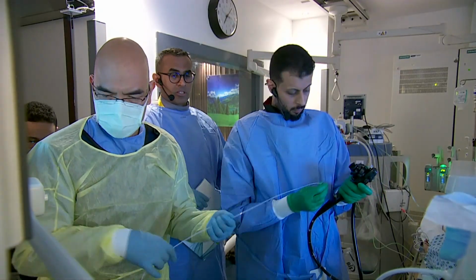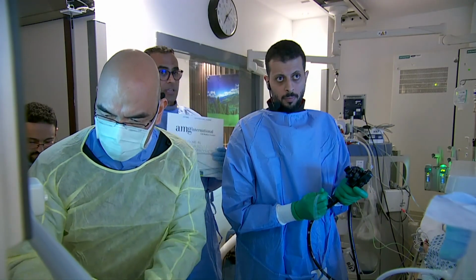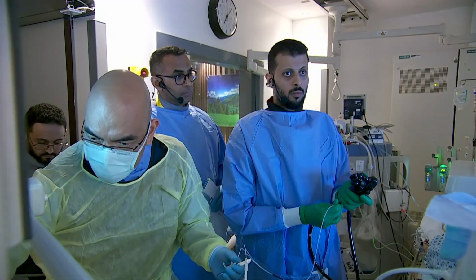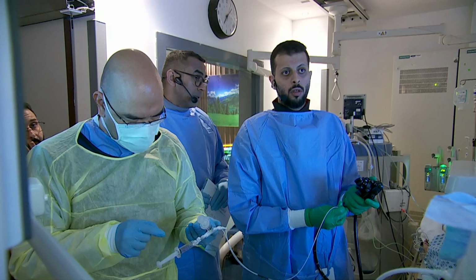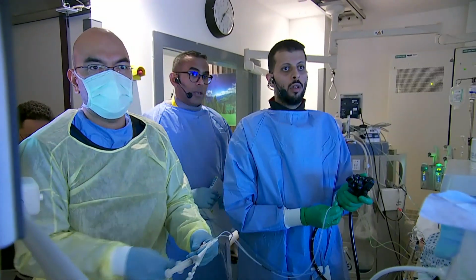So, Imad, this is an uncovered stent, right? They are biodegradable, uncovered plastic stents. Okay, so plastic, yes. Perfect, good. That's an advantage, that you can place it at the bifurcation, at the hilum, so it will not obstruct one of the ducts. It's not like the metallic, so that's the advantage of plastic.